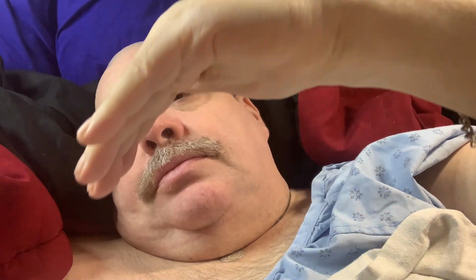The whole point is that you're going to see the graph and see, are you dropping? Are you climbing? That's the main part. So they could not give you totally correct blood sugars. They could be off a bit from what your finger pokes say. They're not going to be exact. They could stop working if you're lying on them funny, or they cost. And that could turn an awful lot of people off. They have to be utilized.